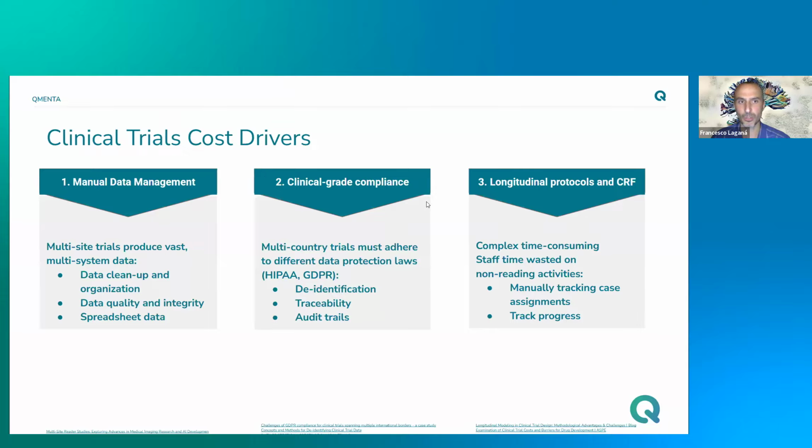First, how much time do your data managers waste on manual tasks, cleaning up files, verifying image quality and completeness, and organizing data even before it reaches the expert reader? These unproductive, repetitive chores are a massive time sink.